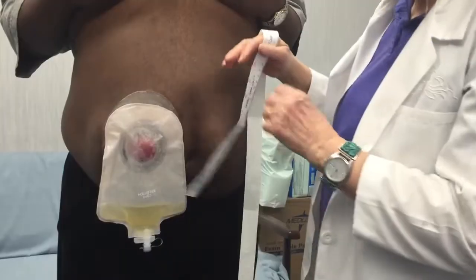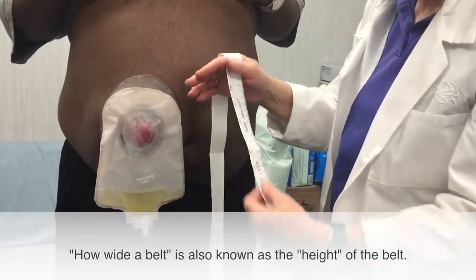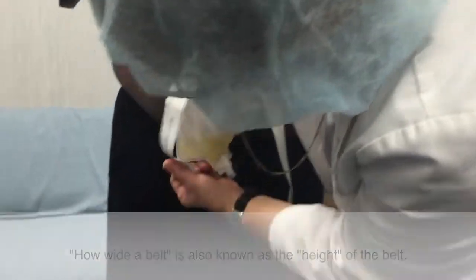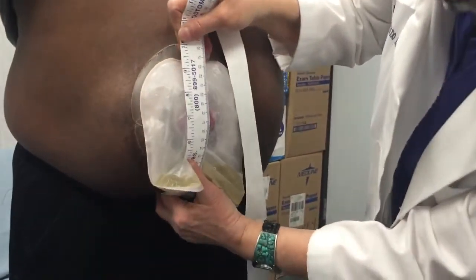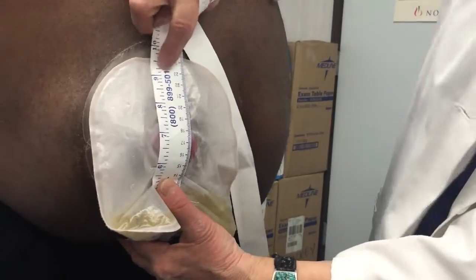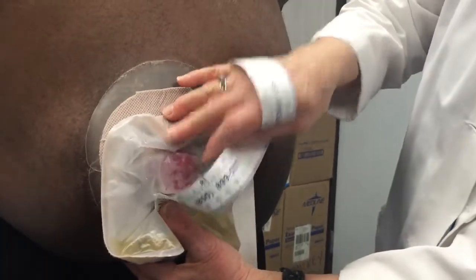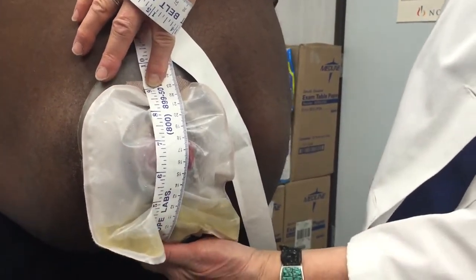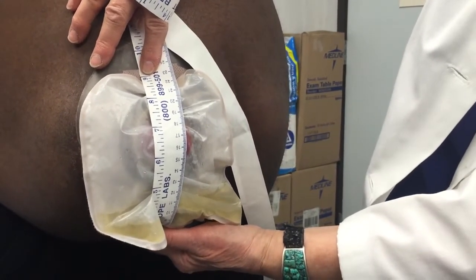While he's standing up, we can determine how wide a belt we're going to need to support this hernia. I'm going to come underneath and come up — you need to have about an inch, minimally three-quarters of an inch, above the weld of the bag. Nine inches is going to give a good width for this belt to support this hernia.